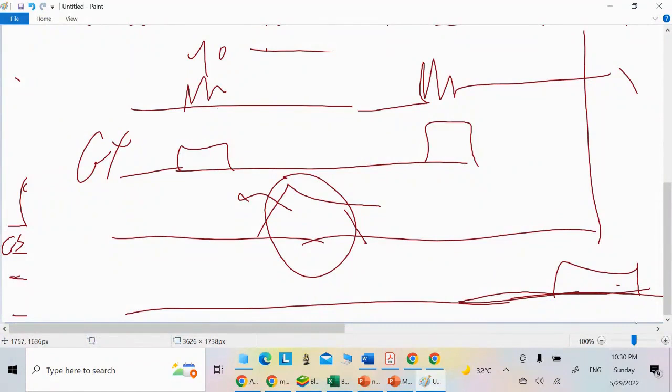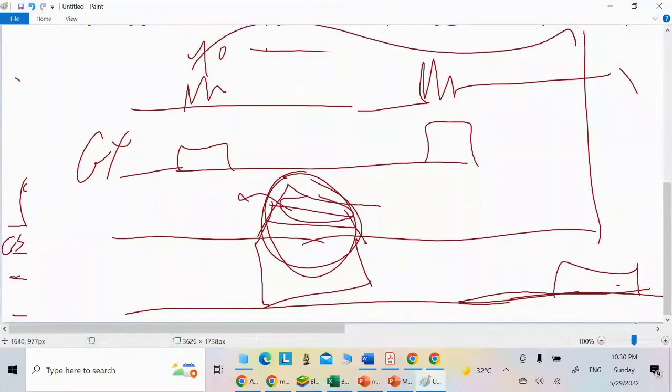So, what does it mean? It means to do what? To do rewinding and dephasing. You detect your signal in the middle, and that's it. This phase encoding is in degrees or steps. Each step you repeat it again with a new step and a new angle.